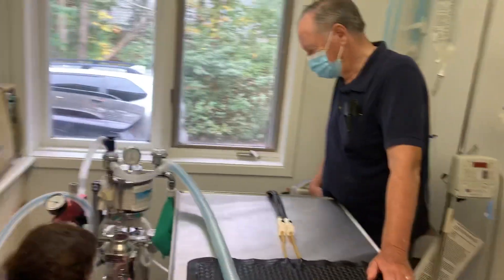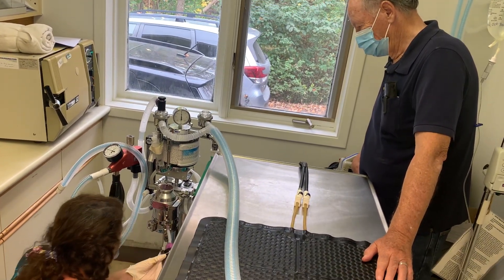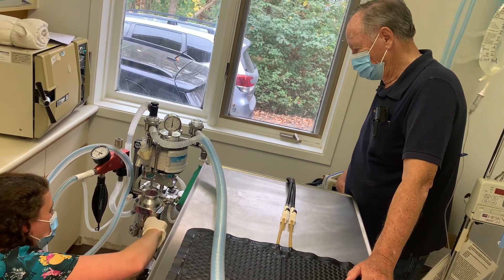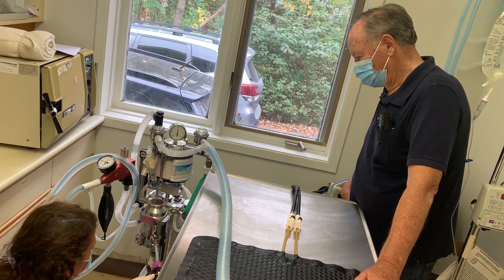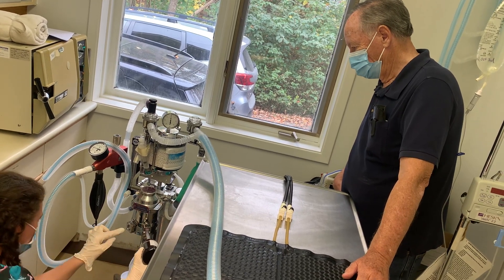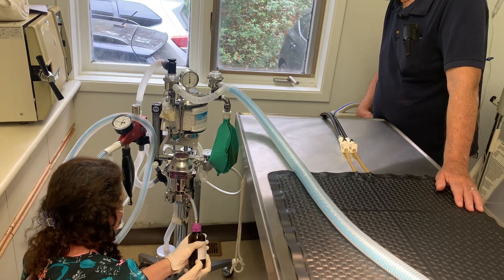I want to put the key in — there's only one way for it to go — and then you want to make sure that you really tighten that up. Now that it's tight, you can tip it up and we can watch our flow meter as it rises. We're now at the top; we can bring this back down.